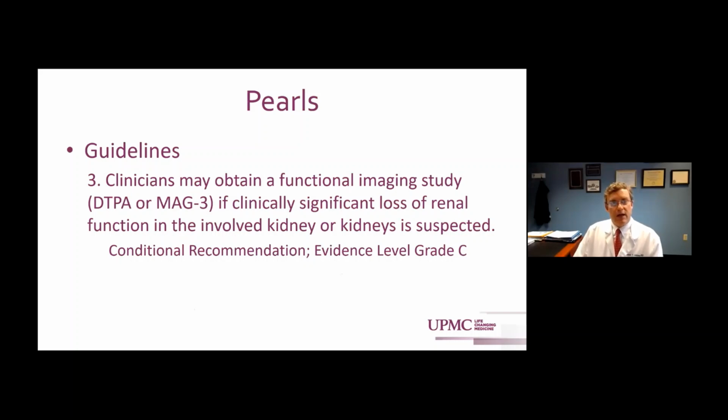Guideline number three was that clinicians may obtain a functional imaging study, such as DTPA or MAG-3. I would also add to that DMSA is actually the best functional study. If clinically significant loss of renal function in the involved kidney or kidneys is suspected, or honestly, if you're trying to decide how am I going to treat this patient, because if you really think that kidney has only 10% function, maybe it's not worth even doing a major percutaneous procedure on them.